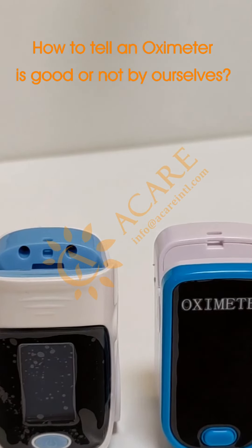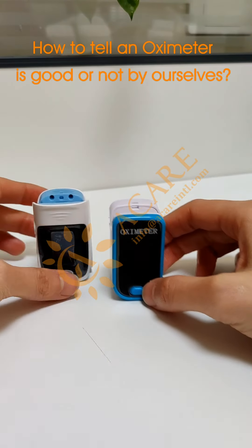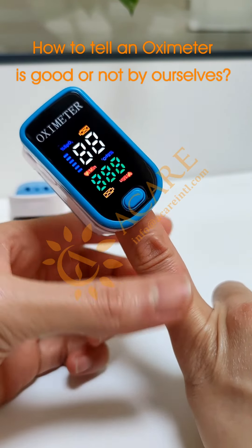Today I will show you how to tell if an oximeter is good or not by ourselves easily. There are two oximeters. Now I will try this one first — put your finger in and click the open button.